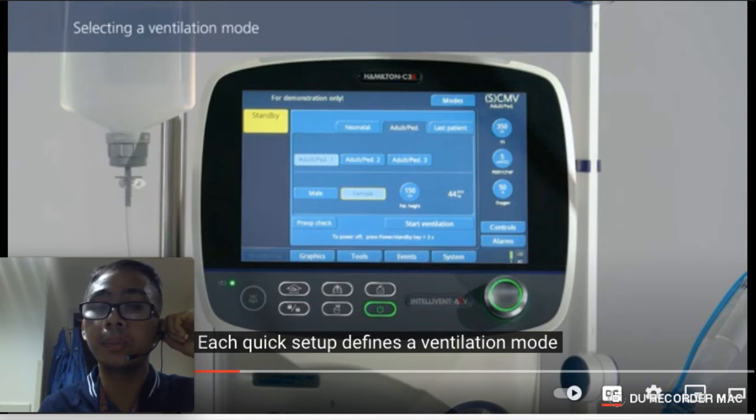And you need also to compute manually, no? Hindi mo, wag mo i-base sa computer kasi sabihin mo millennial age na tayo. We don't need this old school equations, but better to compute manually and memorize the formula of computing rather than relying to the microprocessors of your ventilator, because this technology needs also a human brain, no? Kaya nilagay ka as a respiratory therapist to control and manipulate ventilator, hindi ikaw ang kontrolin ng ventilator, because this ventilator are machines that is programmed based on a normal, again, based on a normal lung condition.